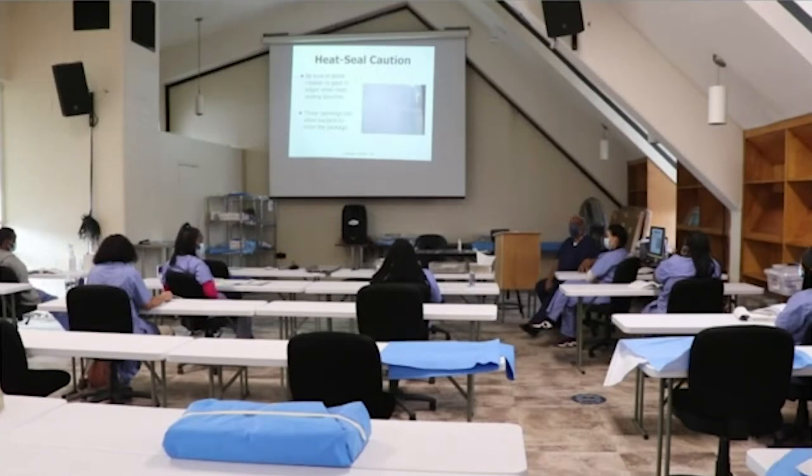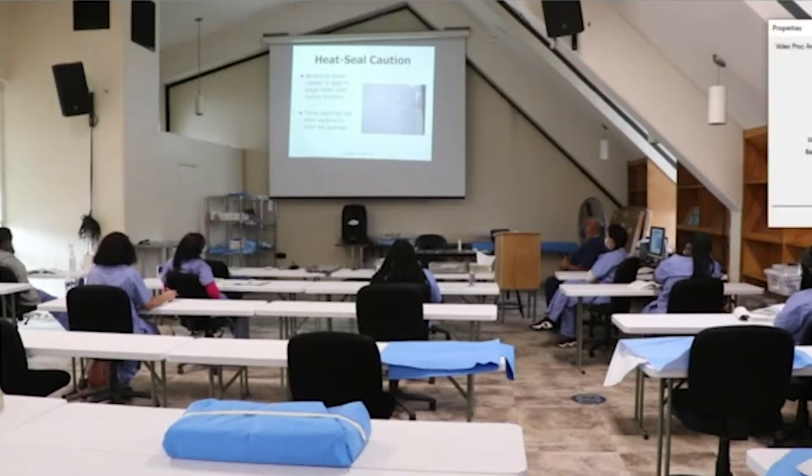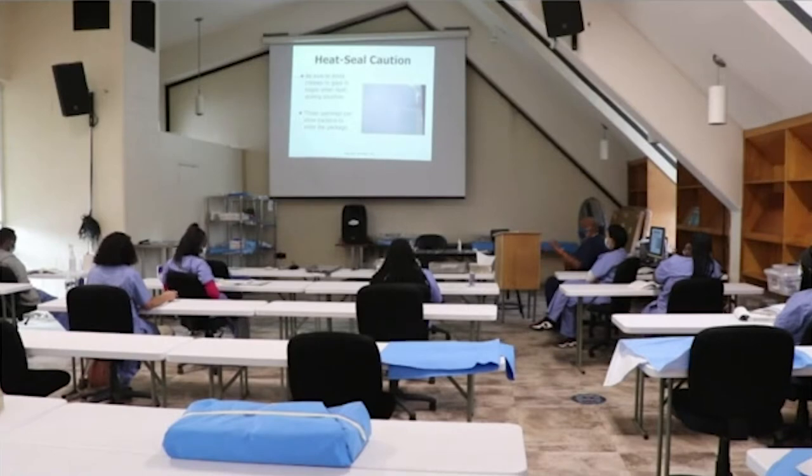We can't see them, but they're there, right? And what we have found out, and COVID is a prime example, is that what you don't see can be more deadly or harmful than what you see, correct? So our job is to make sure that those unseen microorganisms don't come into contact with our patients. Good. This is an example of something that wasn't done so good.